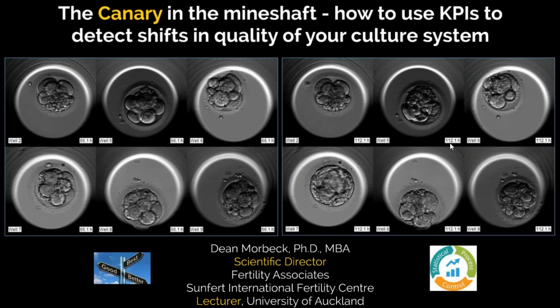The pattern of blastocyst development that I've historically seen is that overall about 50% of 2PNs make it to a blastocyst that's usable, and 35 to 40% make it on day 5, meaning that only 10 to 15% are on day 6. So if we looked at a graph of that, you would see the peak of blasts on day 5, and then a tail for those on day 6. It sounds like yours are peaking on day 6, which means that they're growing more slowly.